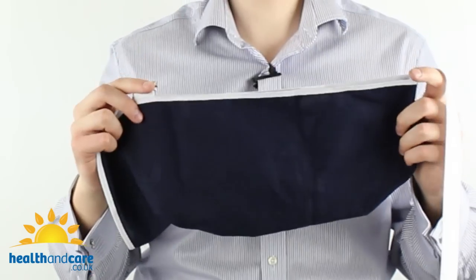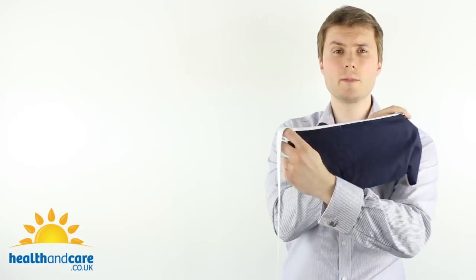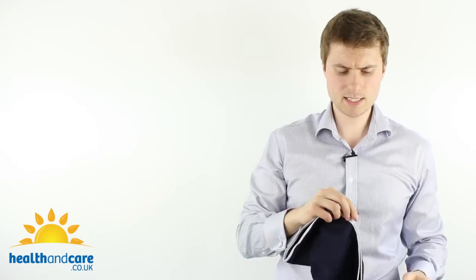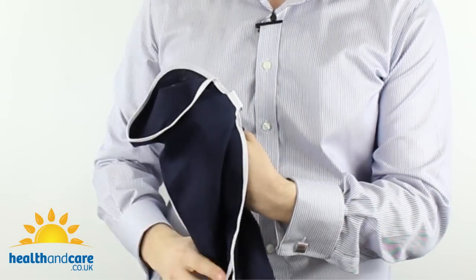Now let's take a look at how to put the sling on. When the Cotton Arm Sling arrives it's going to look like this. I'm going to be showing you how to put the arm sling on your left arm, but if you're going to be wearing it on your right arm, simply switch the envelope around and follow the same instructions. The best way to put this arm sling on is to take the sling with the opening here and thread your hand straight through that opening.